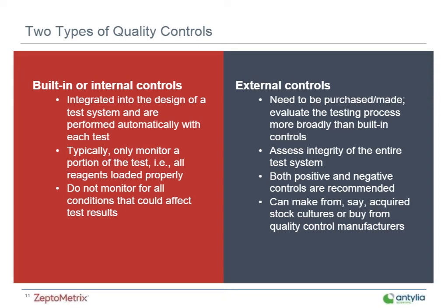If you're using pooled patient samples, it's important to consider if that's the right fit for your lab because they likely do not meet ISO standards. It's just something to think about. And really, controls are substances that contain an established amount of the analyte that's being tested. You want to use external controls to test at the same time and in the same way as your patient samples are being tested.